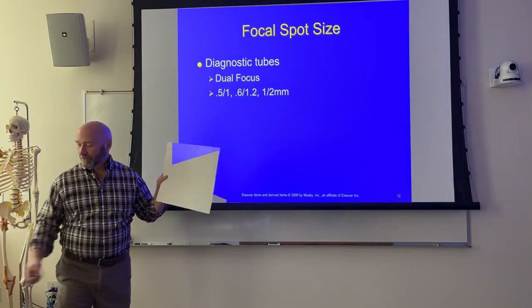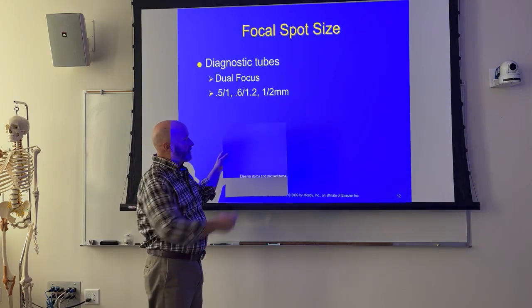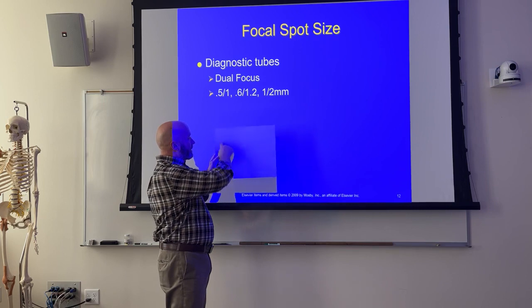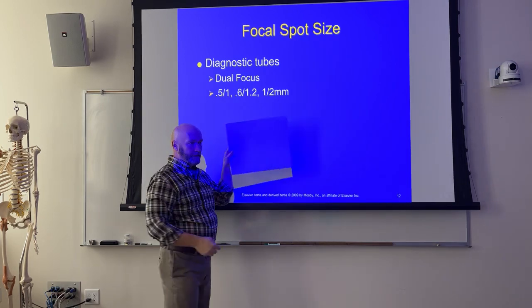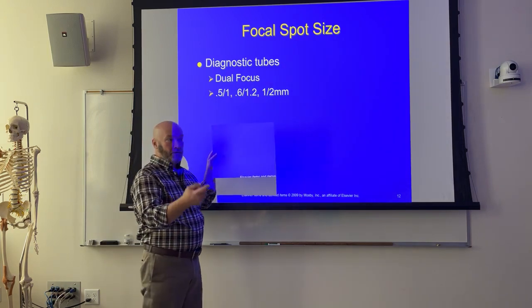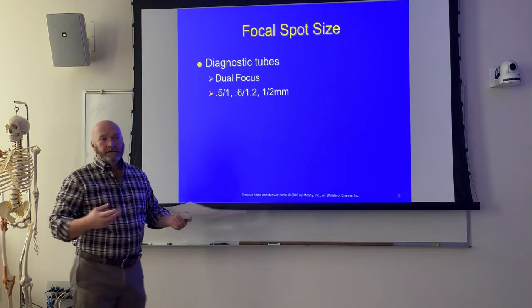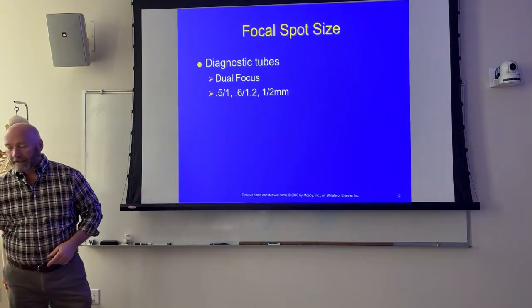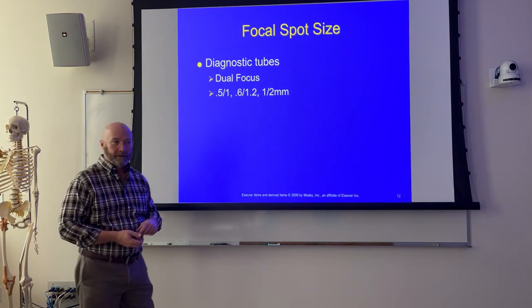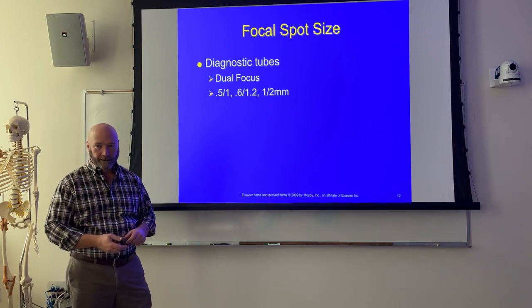But, of course, the button's only 1 inch by 1 inch. So if you're looking at a large focal spot, then what you're going to see is colored in, or at least a square inside of that button that almost takes up the entire button, okay? So that's large focal spot. Small focal spot's going to be a small square in it, all right? So that's an indication of what your focal spot is. So you select a KUB, and what it's going to automatically default to is large focal spot.